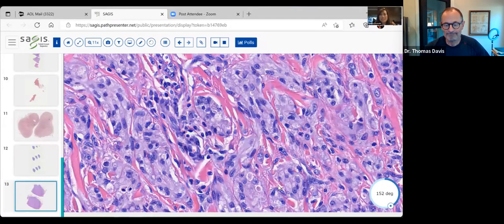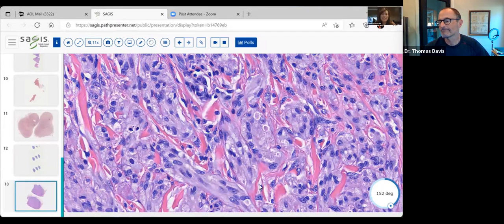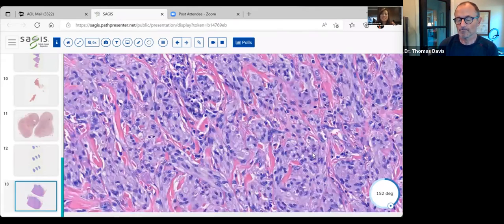Well, that ends my session on giant cells. I think you can see there's a wide spectrum of giant cells. I could have added probably 15, 20 more. Some are to the benefit of the patient, and some of them aren't. It could be a nuisance, cause tumors, or even be life-threatening. So I hope you spend time to look at these and find the differences and similarities between these entities and look for other giant cells to study.